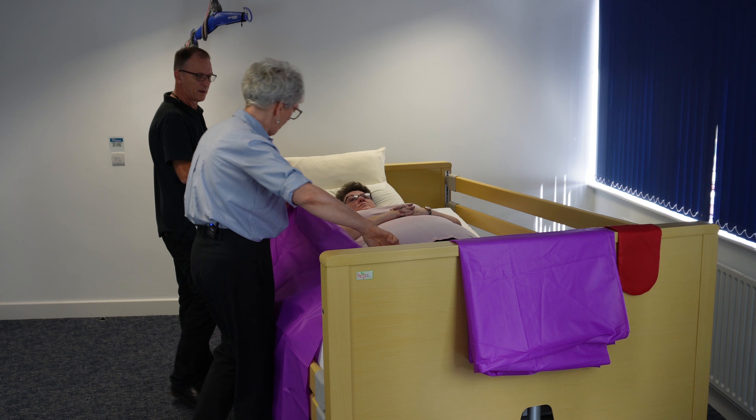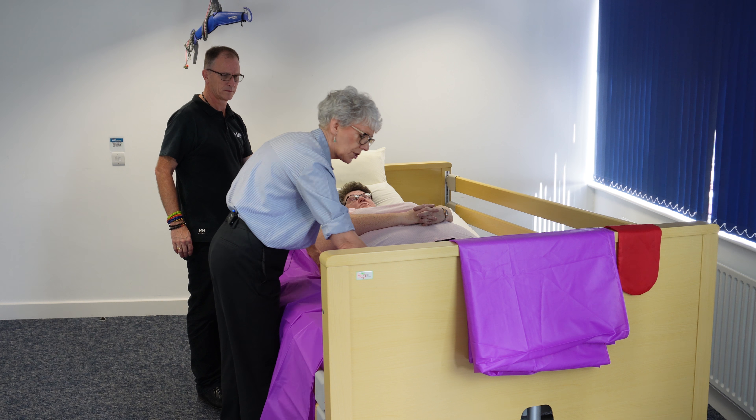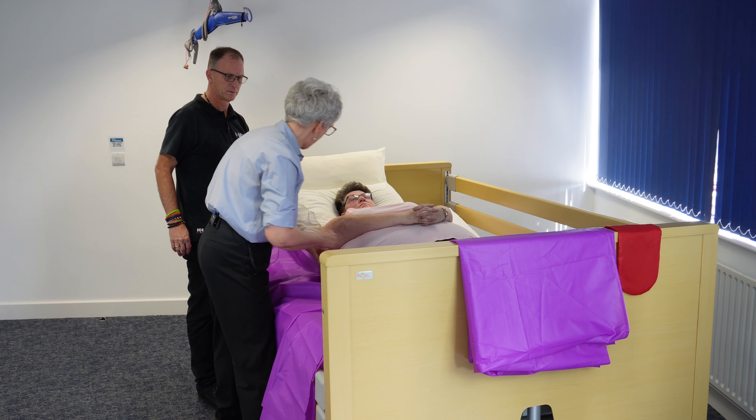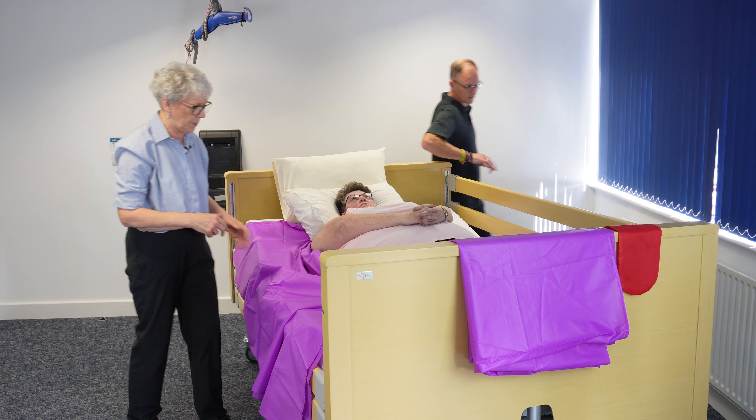I'm going to lay that on the bed before I get Lou ready to roll. To stop them sliding off the bed, I'm just going to tuck it underneath a calf and underneath her pillow. And if I could ask Chris to go around the other side to assist a little bit.